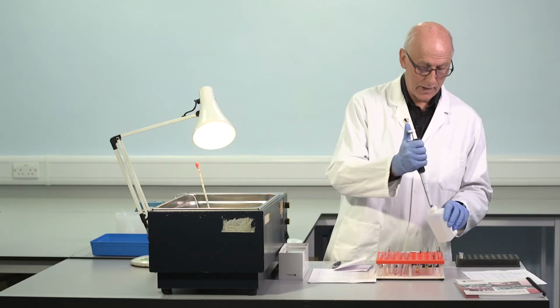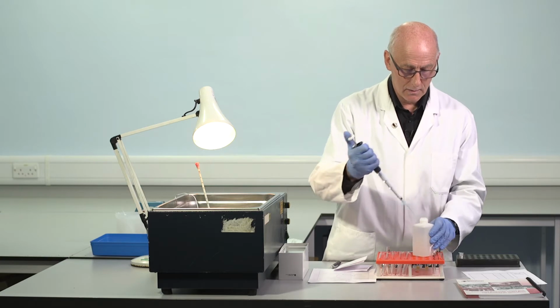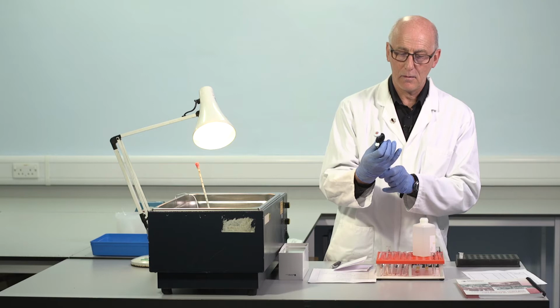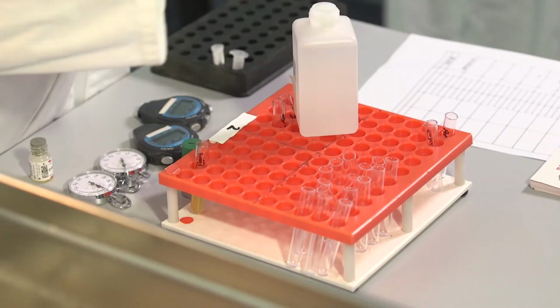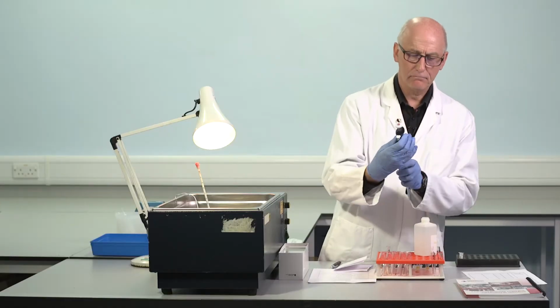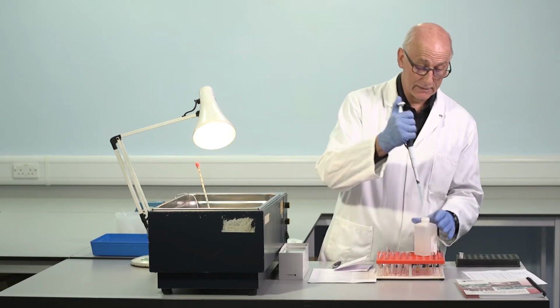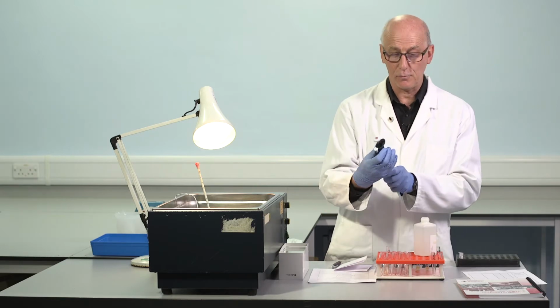So we need to pipette some buffer, 0.9, 1.9, and then 3.9. And in a moment we'll be diluting the reference material into each of these tubes.